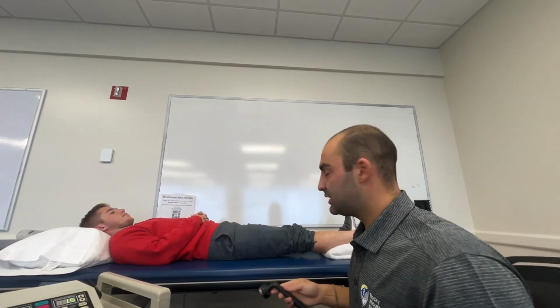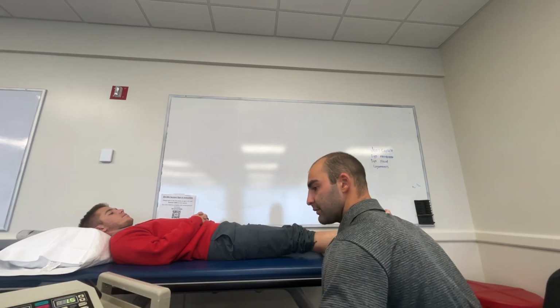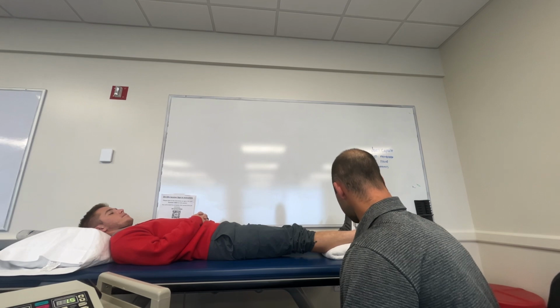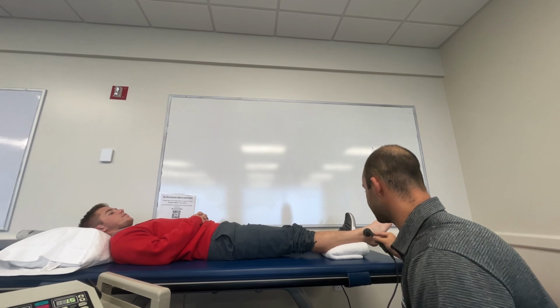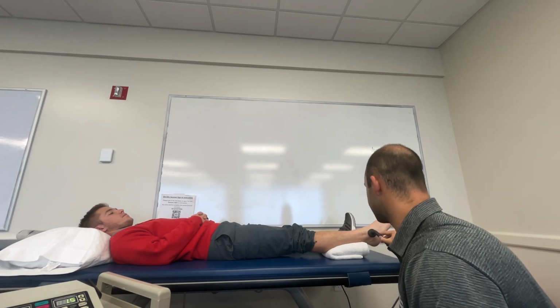And then before I start our ultrasound machine, I do have to make sure our head is in contact with the area that we're treating in order to ensure we're not damaging the crystal inside the head. The ERA for ultrasound is about half the size of the ultrasound head that we're using, and the area of treatment is about 2 to 4 times the size of that head.